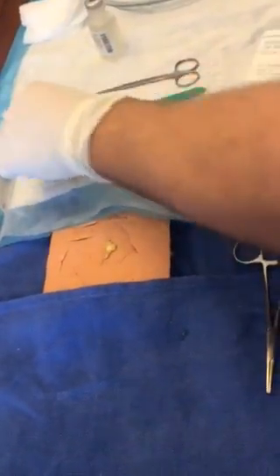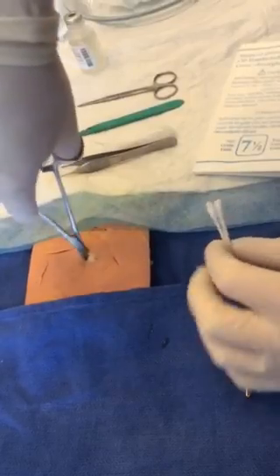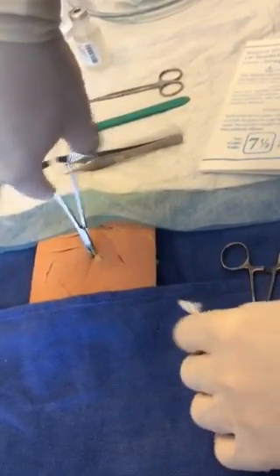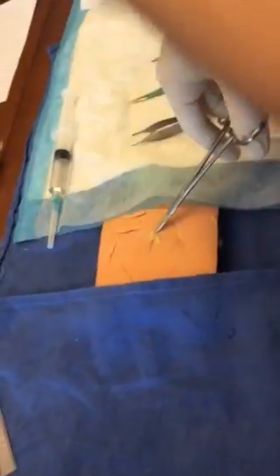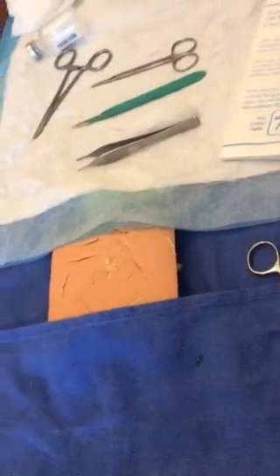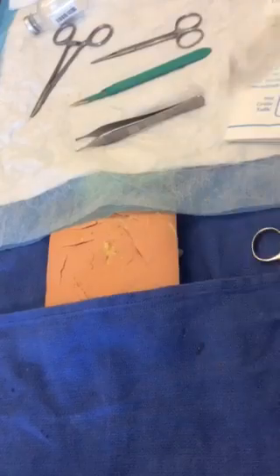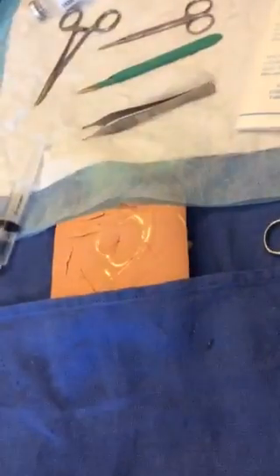We will take our curved Kellys here, and we will open this up to break up potential loculations that are still in the wound. While we're here, just to rule out infections, we will send a culture to the lab. So here, we've got a specimen. That goes to the lab for culture. Breaking it up. Following this, once we feel like we've gotten all of the pus out, we will then irrigate the abscess with a saline solution. Okay? And then we'll still be soaking that up.